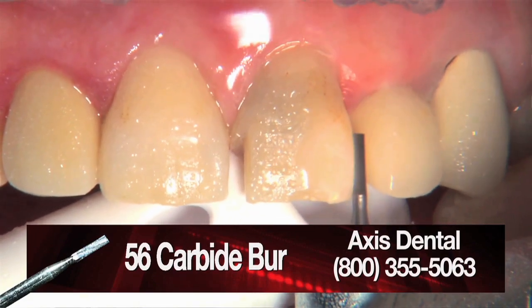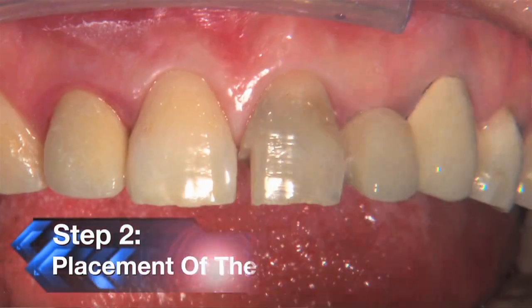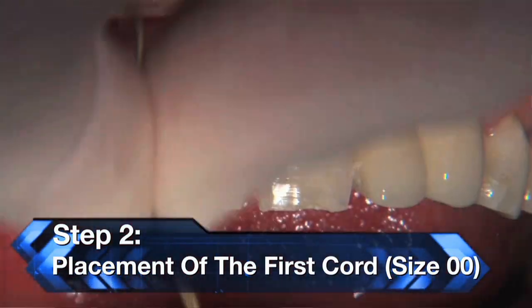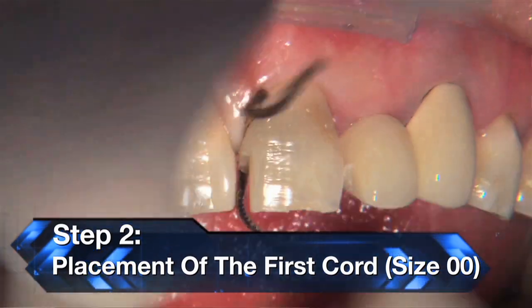And the reason we're doing this first is because this next step, we want to go ahead and get a double zero cord into place. And so we're going to place this double zero cord. I'm going to floss it into place. And what I mean by that is use it just like dental floss.